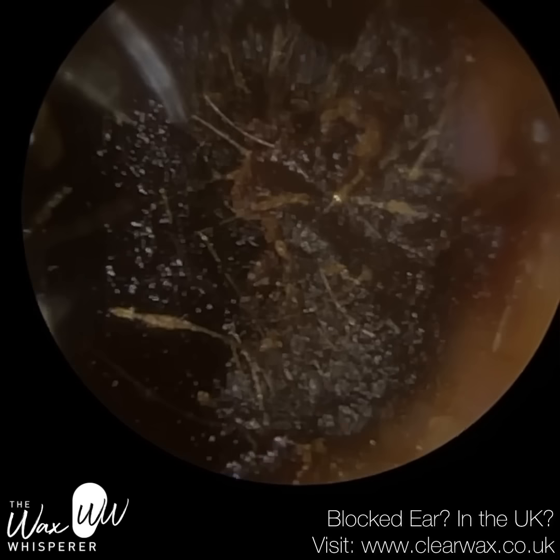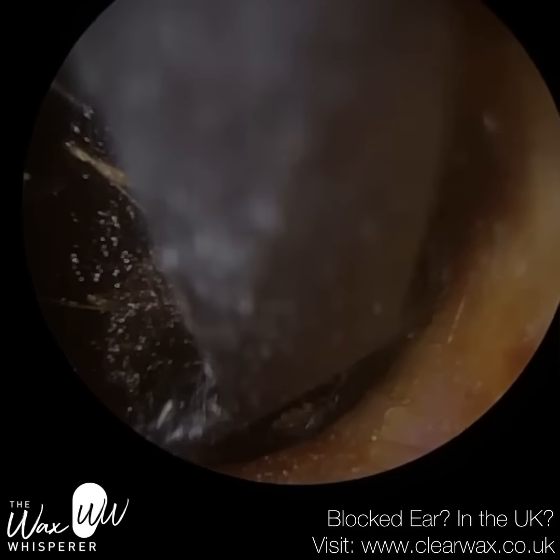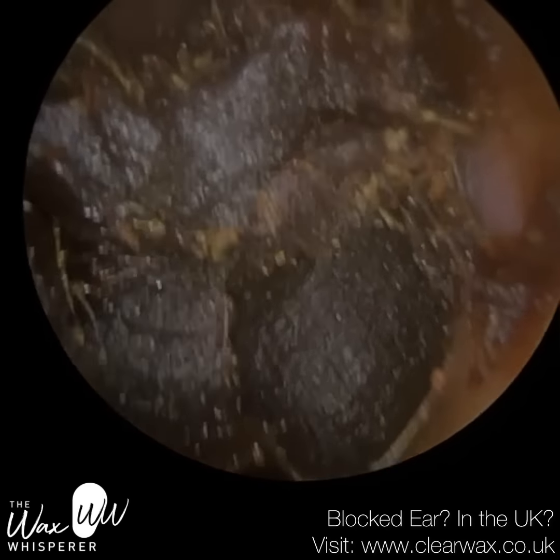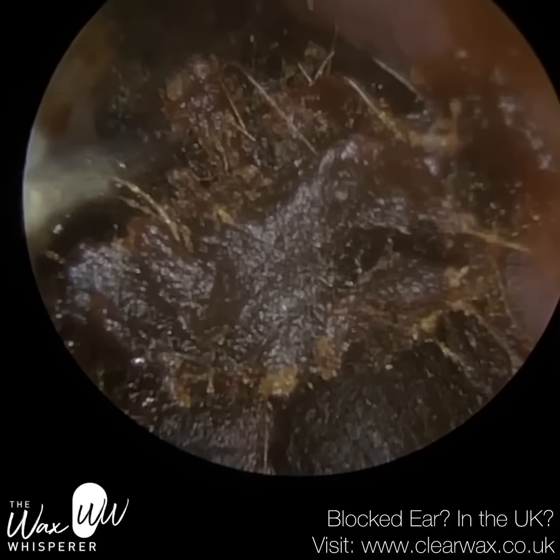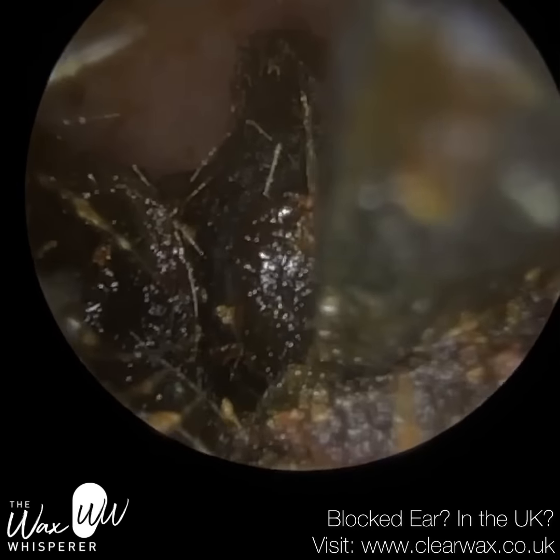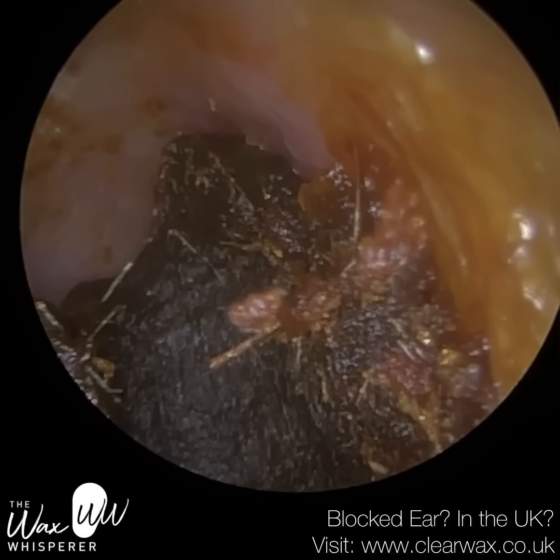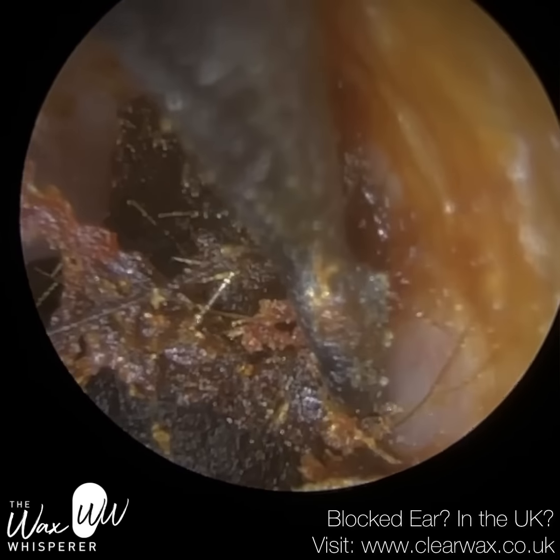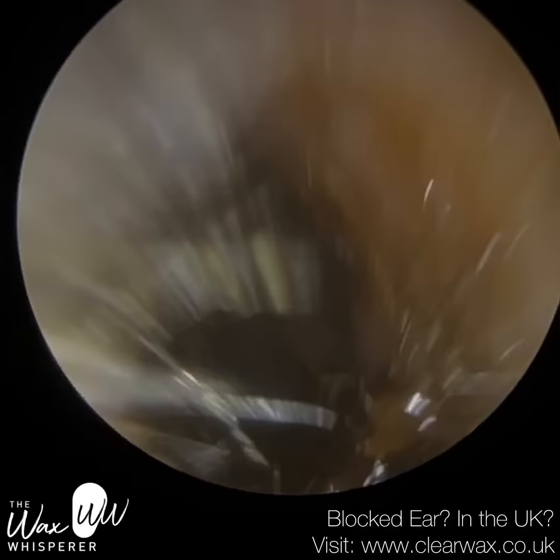I'm going to use the curette now, being careful because we're moving on to the bony part of the ear canal. This is where the design of the curette really comes in handy — you can see it's arched and curved, which mimics the curvature of the ear canal and therefore minimizes friction. The wax is quite soft and mushy — not firm — it's a soft dense rather than a hard dense; very thick mud, a clay-like consistency. I usually wouldn't use a standard curette on the bony part unless I really have to, but with the right curette I'm more confident to glide across it.